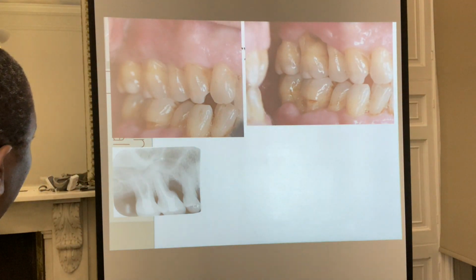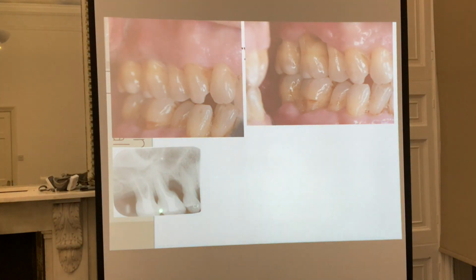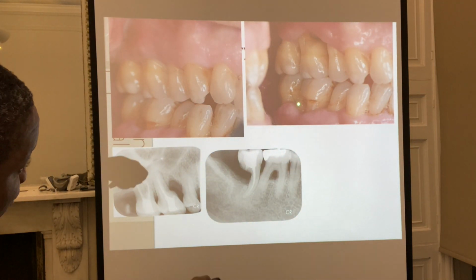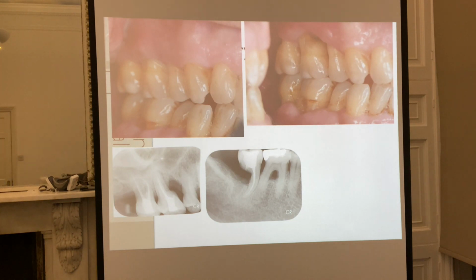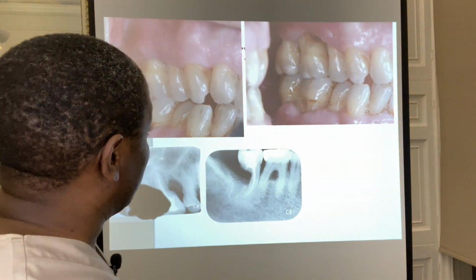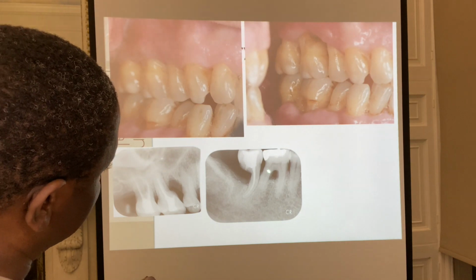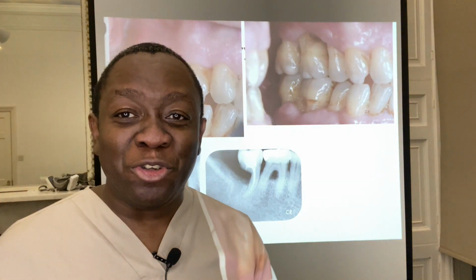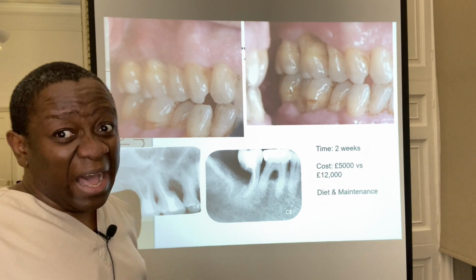Because I had removed the roots, what I had to do was get our wonderful root canal specialist, Niha, to do some beautiful root canal treatments. And this is an X-ray of her root canal treatments. These white lines are what she did for us on the upper right, second to last and last tooth. And again, on the lower right here, as I said to you, I removed one of the roots, and that's why there's this area here with essentially a missing root. But I didn't need to do it for the penultimate tooth on the lower right, and so our patient is able to insert a TePe brush, a normal interdental brush, into that gap, leading to excellent prognosis in the long term.